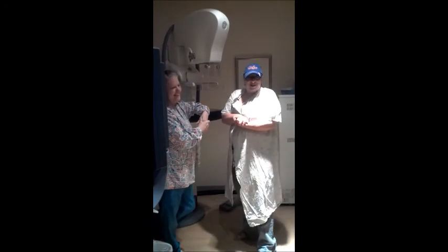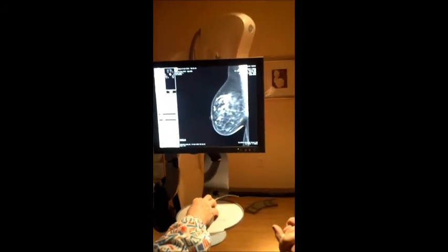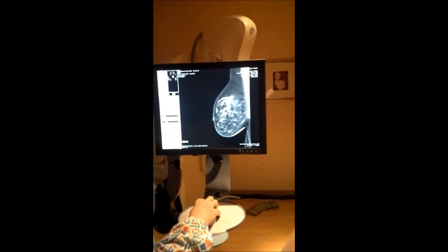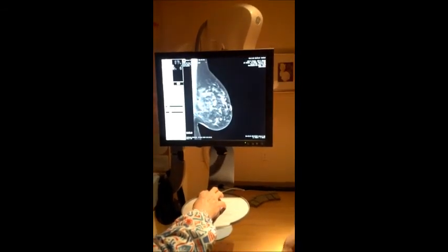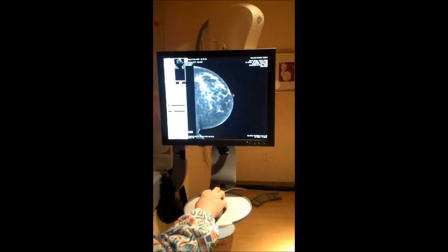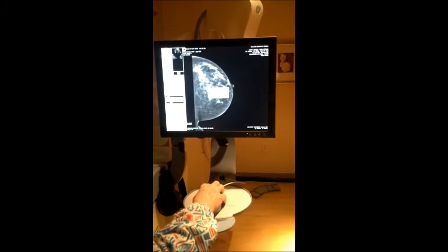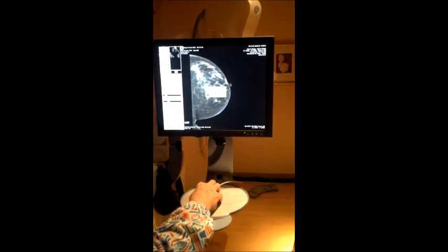Just to see the pictures. You can see them over here if you like. This is what's nice about digital. That is the last picture we took. This is your other side. And these are the first two, how it looks. This is digital — all I do is hit this key and it is sent to the radiologist's office, where he proceeds to read them.